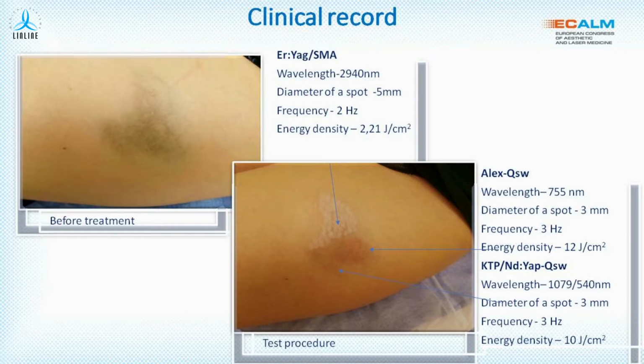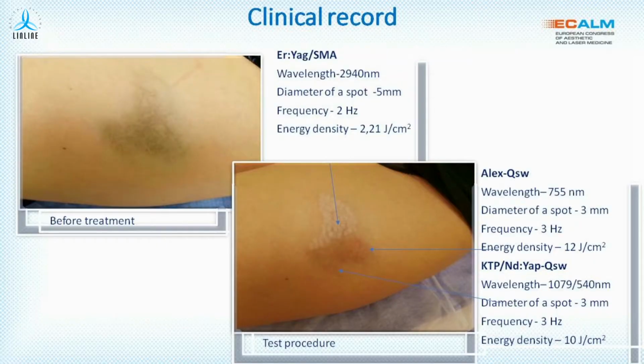The dyschromia appeared as a result of an iron administration 2 years ago. She has been conducting therapy on the dyschromia during these 2 years. She underwent mesotherapy, PRP therapy, and hirudotherapy, which led to the scar formation.